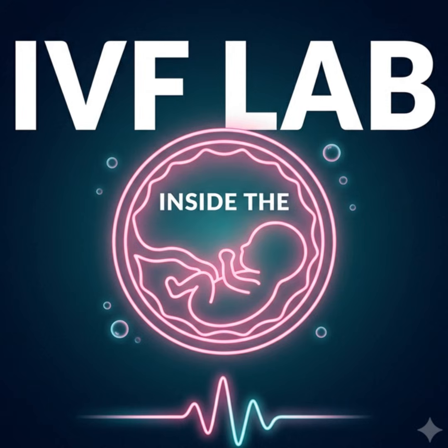Okay, so once the cells are perfectly positioned in that minimal picoliter volume, the final plunge happens. Yeah. And the methodology behind this plunge differs across the industry, right? It does. Laboratories actually have to choose between utilizing open systems or closed systems. Right, and this is a major operational and philosophical distinction in the field of cryobiology. How so? Well, in an open system, the microscopic film carrying the oocyte is plunged directly, just bare and completely exposed, right into the pool of liquid nitrogen. Oh, wow. Just right in there.